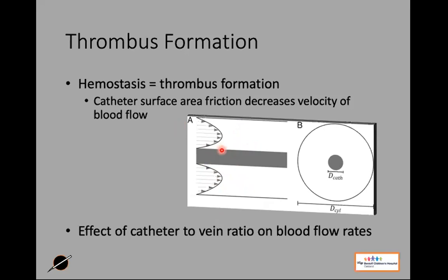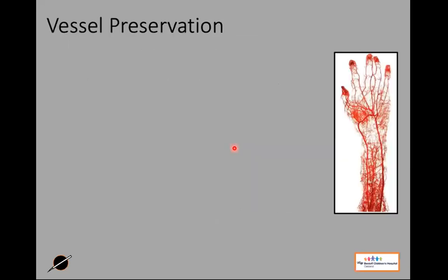So we're going to tamp down that go big or go home kind of idea in some sense. Okay, because a lot of times we're looking at hard sticks. We're looking for those smaller blood vessels. We don't want to throw a 20 into a nice tiny little vein.